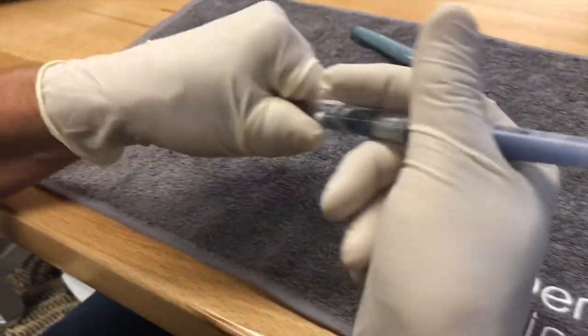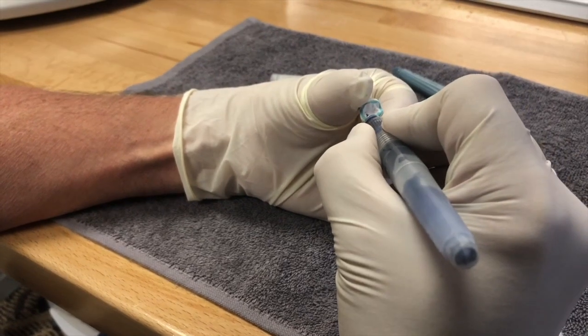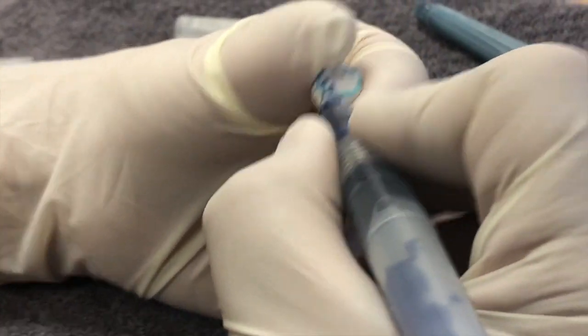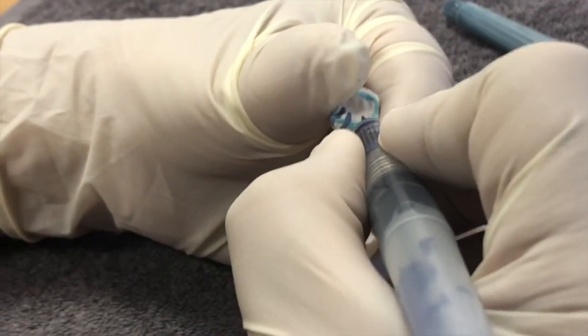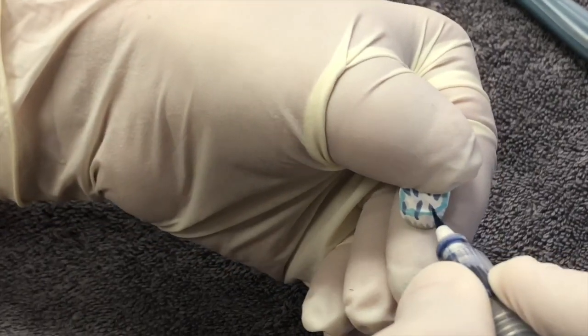Then I'll use my violet incisal. I'll come over on each side of these cusp tips and come down into the incisal area on the facial. I'll do the same on the linguals.